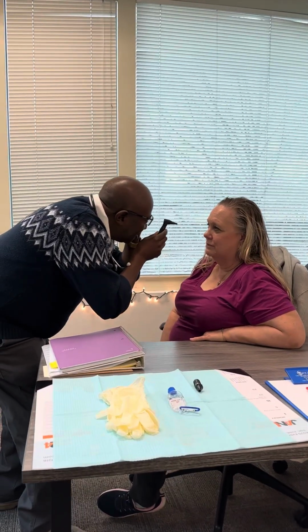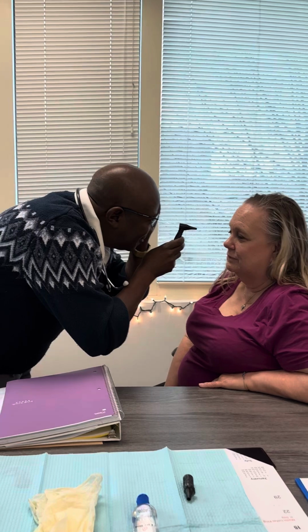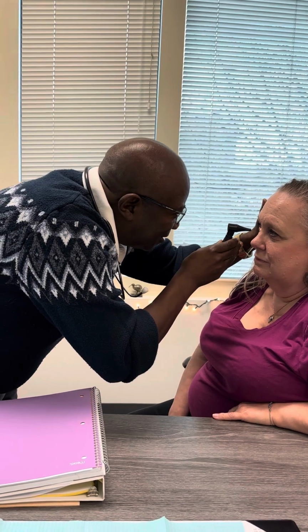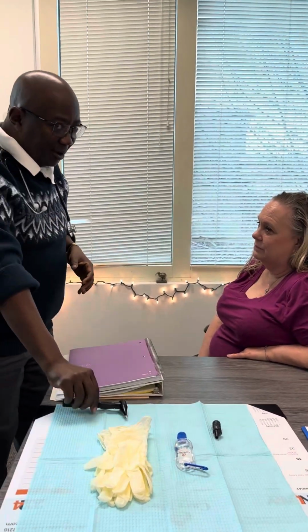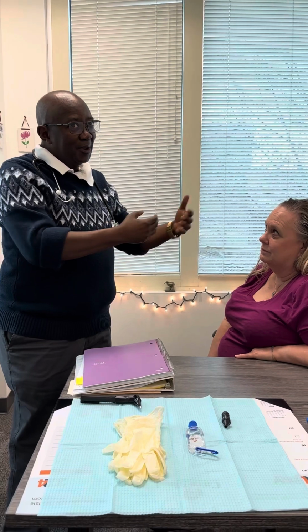When I look at the eye, I'm looking for the red reflexes. When I see the red reflex, I will hold the head and go straight with my fingers like that. The reason I'm doing that is because I don't want to see any bump.